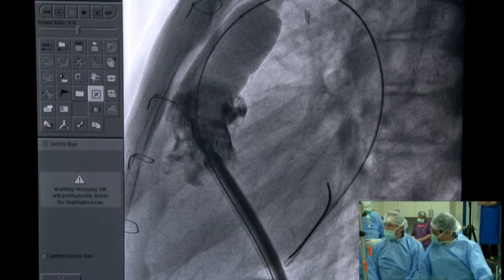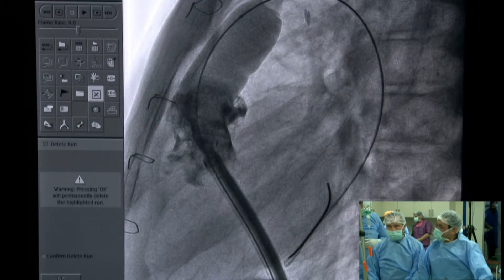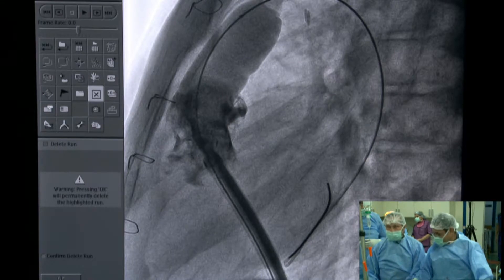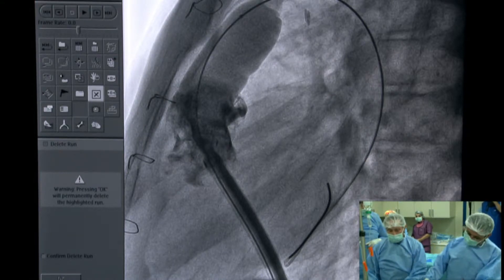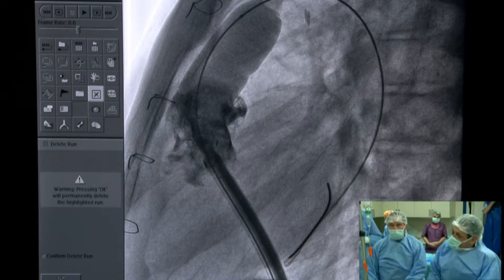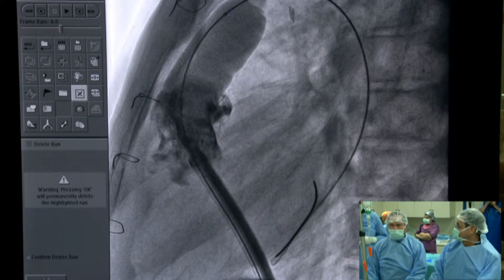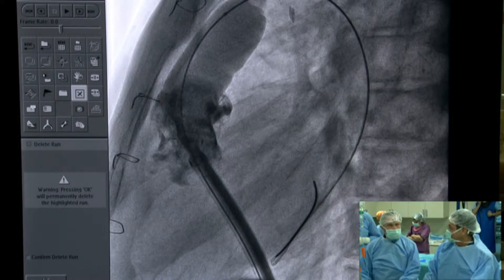Is that the balloon you're looking at in the fluoroscopic pictures now? Mario, your voice is very low, you can maybe shout a little bit to hear. We cannot hear you very well. We have only a 25-millimeter balloon. I'm shouting now. I cannot speak louder than this.